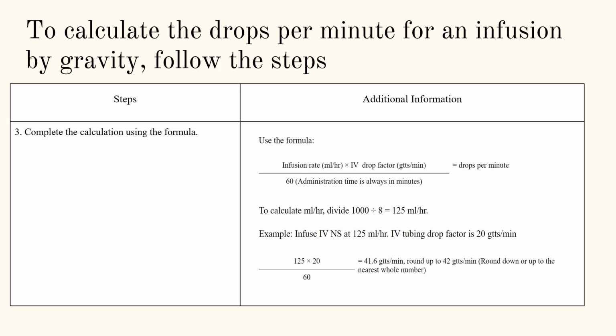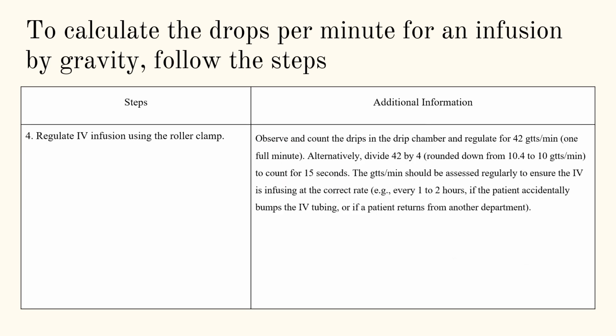per minute. Oh, it was so tedious. We would, again, like I said, regulate this, and I will show you this in class just so you could see what we used to have to do. We don't do this anymore. Typically, it's usually done via a pump or a syringe pump or a dial of flow. There's all different ways that we do this other than just gravity now.